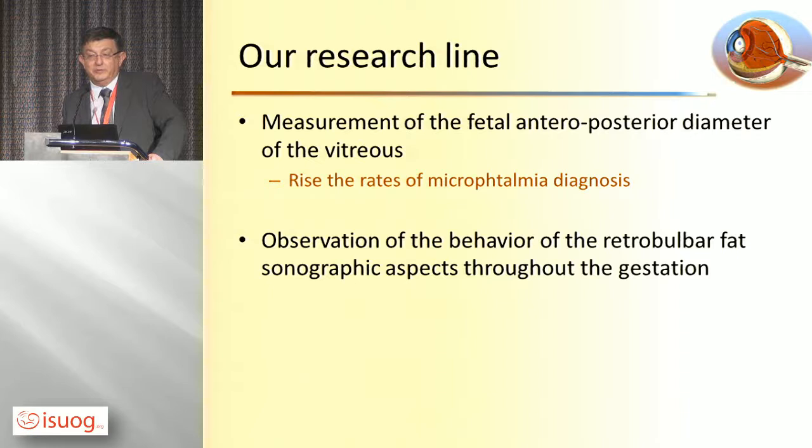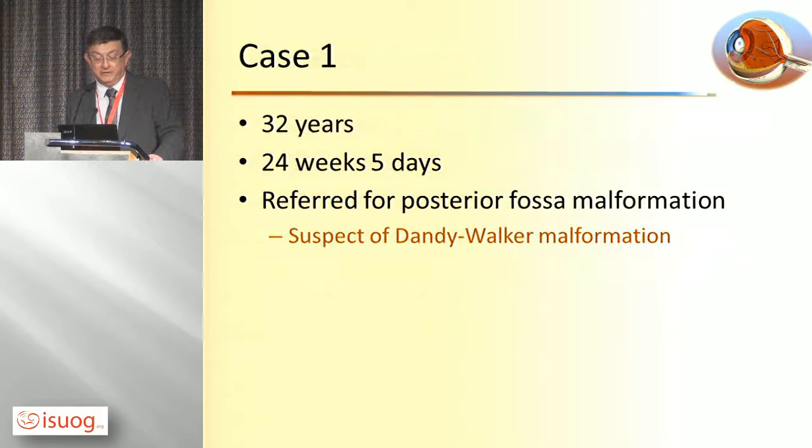And this is important also for other conditions, such as pericallosal lipomas, I will show you cases today, or in cases of closed spina bifida, where there is always the question: is there a lipoma or not? You can be sure that there is a pathological closed neural tube, but we will never be able to know for sure whether there is a lipoma until the third trimester, or it will be difficult.